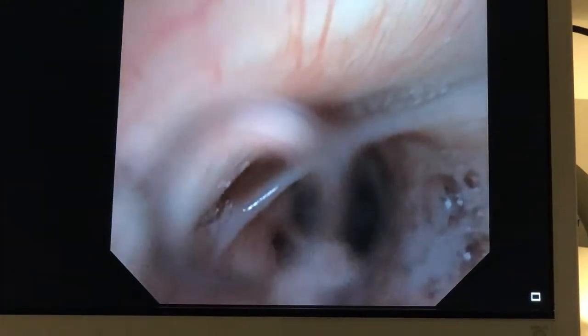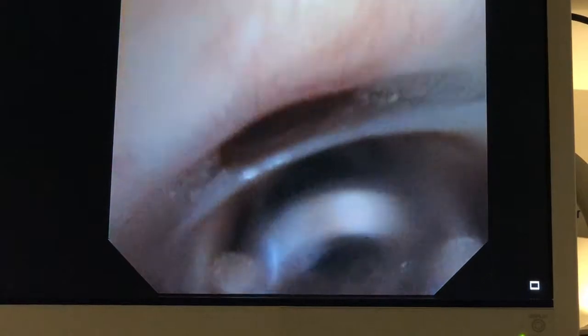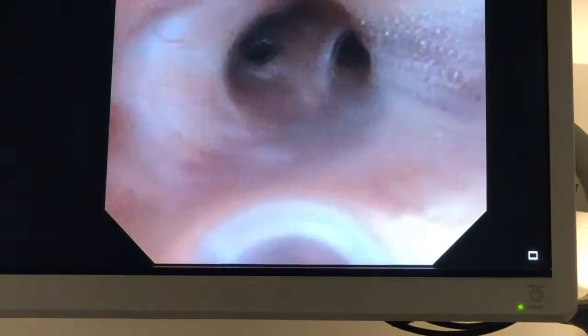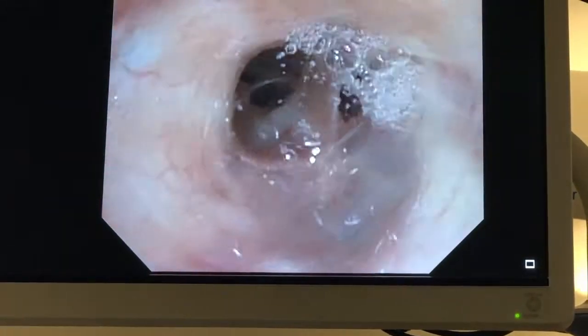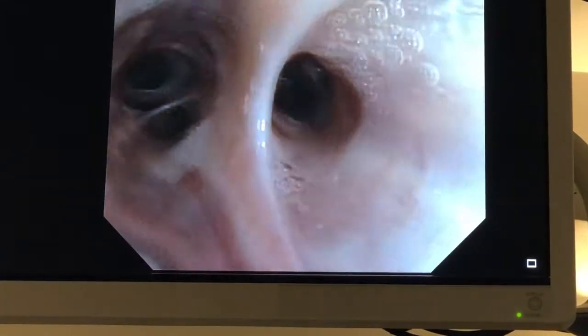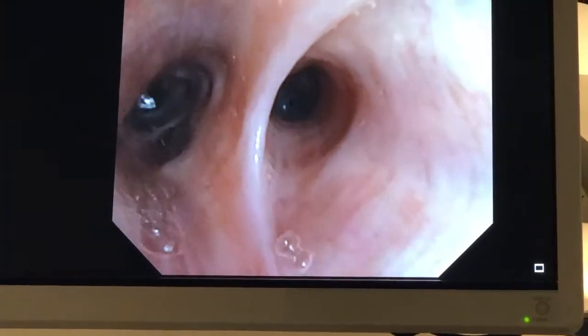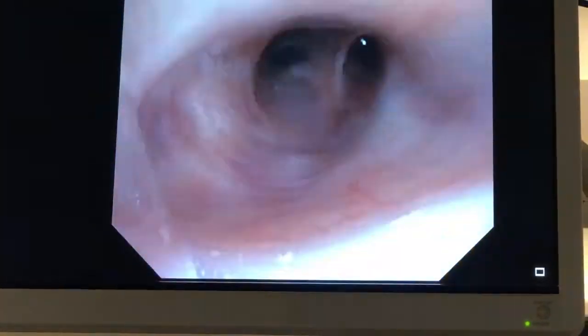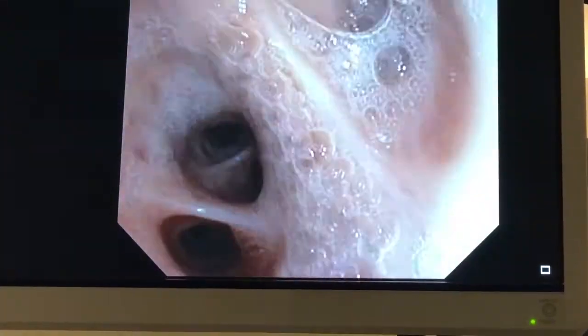The airways are patent. Come back into the bronchus intermedius and go into the right middle lobe. The right middle lobe, as we expected from the CT, is clear — no endobronchial lesion there, no abnormal secretions.